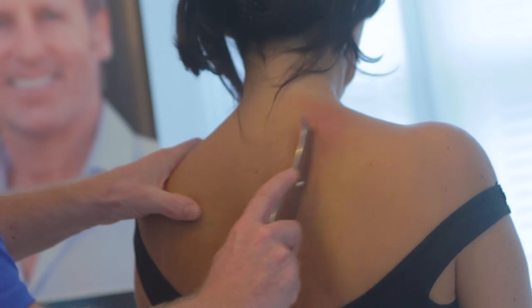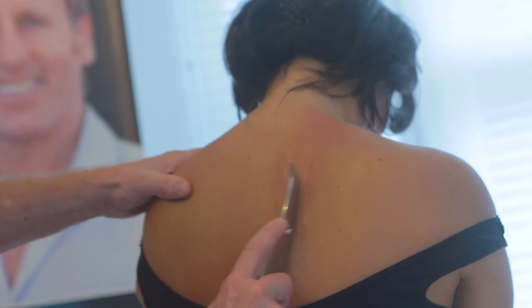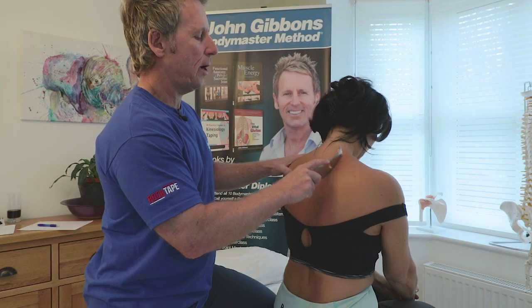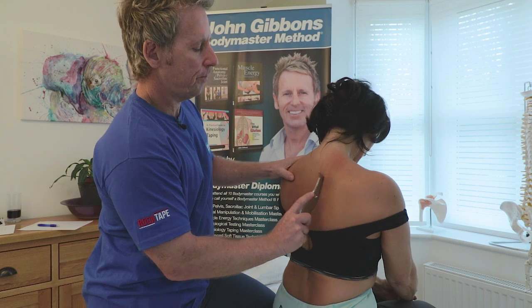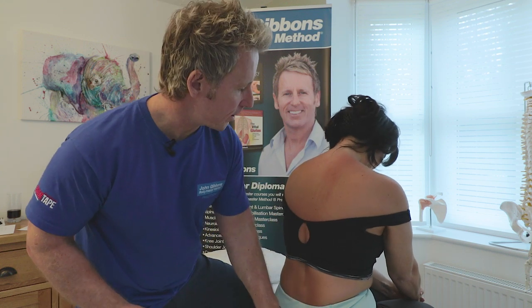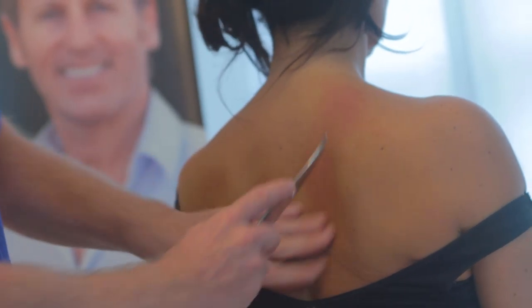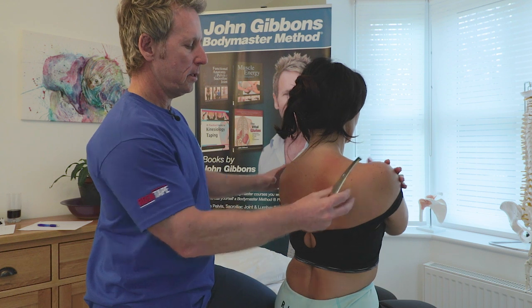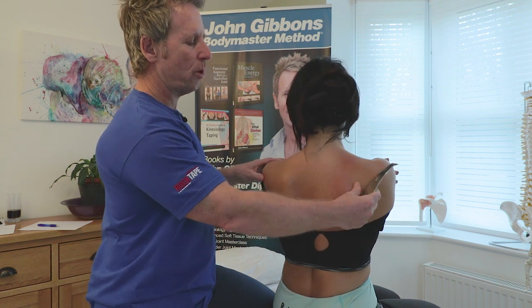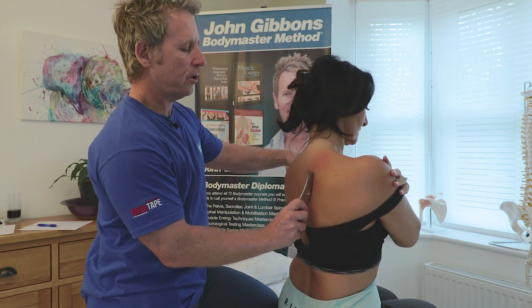This is working through into the rhomboids. You can see what the patient is naturally doing — she is starting to flex in the c-spine and then round the shoulders, where I can just work through the whole area. Coming across into that area in here, just put a little bit more wax there. Every now and again just add a little bit more. What's also quite nice is to have the patient place their arms across their chest.